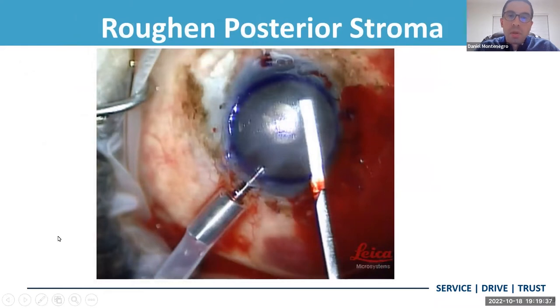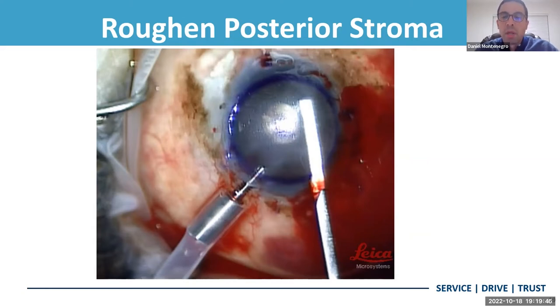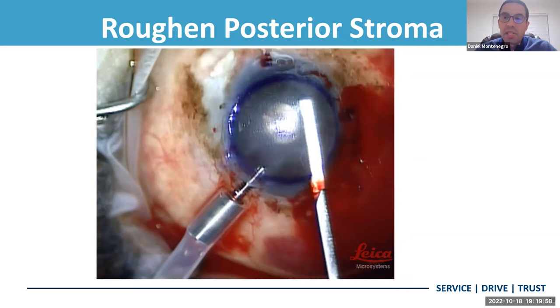This is the scoring and stripping of Descemet's membrane in this patient with pseudophakic bullous keratopathy. We use a reverse Sinsky hook. Once we've scored Descemet's membrane and separated it, we use our Utrata forceps to remove the Descemet membrane. A very important step is to roughen the stroma. By roughening the stroma, we promote adhesion of the DSAEK graft to the patient's own stroma. You have to make sure to really roughen that stroma in the periphery, because in these patients with a trab or a tube, the air fill might not be great — so by roughening the posterior stroma, you don't rely so much on a good air fill at the end of the case.